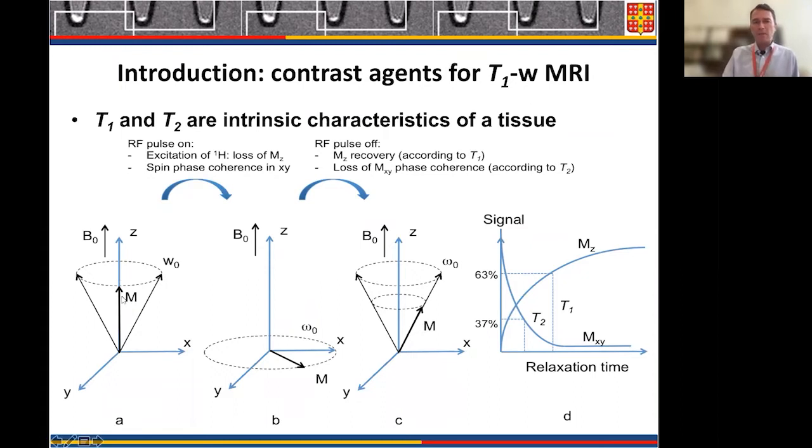And this specific wavelength will have the capacity to tilt the magnetization vector of the macroscopic signal of each one of the tissues, symbolized here by capital M. So this vector will be tilted in the XY plane, and it will start rotating around the Z-axis. And progressively, when you turn off the radio frequency, the main magnetization vector of each one of the tissues will be recovered.